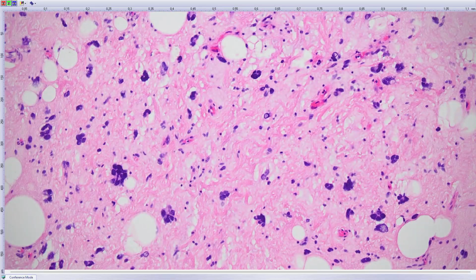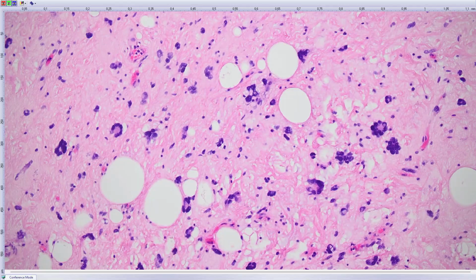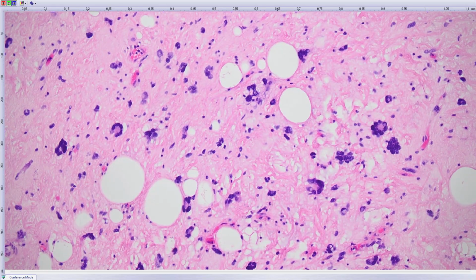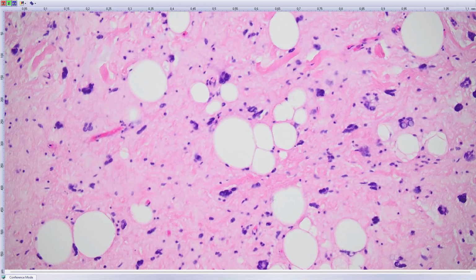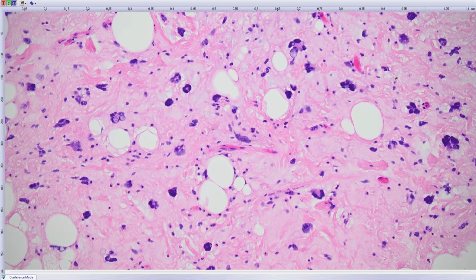So, any suggestions from the youngsters here? This genius Singer, he recognized it in 1960. Can you imagine? He recognized it 65 years ago, that it's a benign lesion. Yes. You should not call it atypical lipomatous tumor.